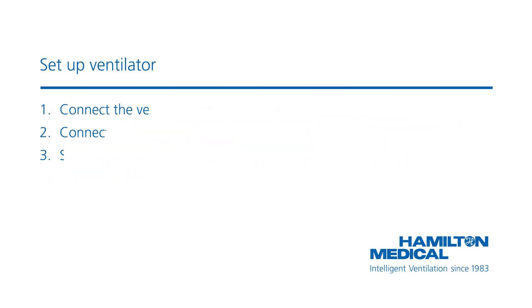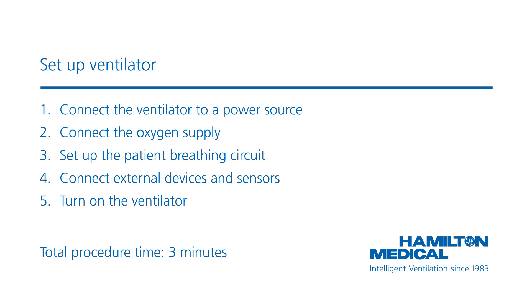There are a few steps you need to follow before starting ventilation. The whole procedure takes approximately 3 minutes.